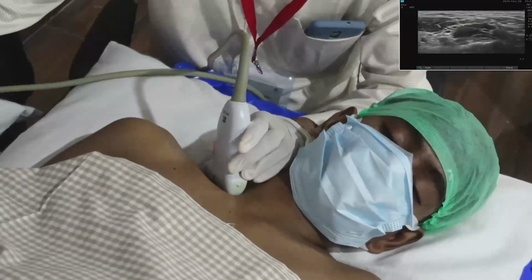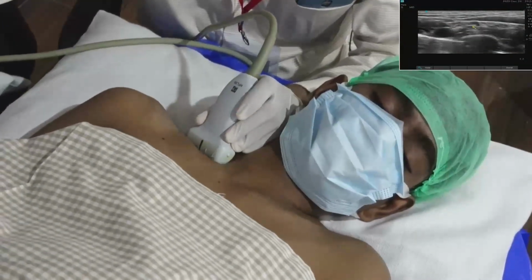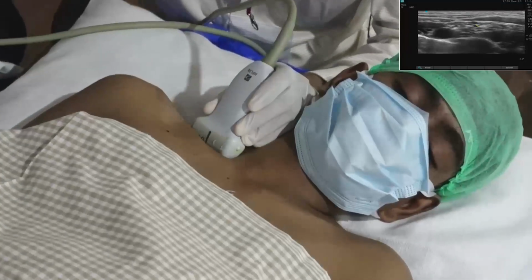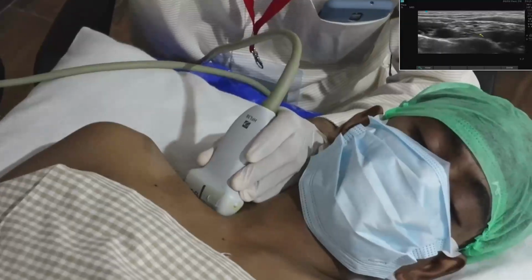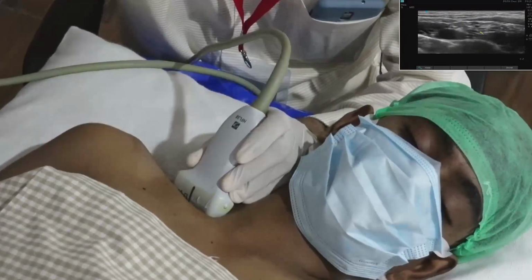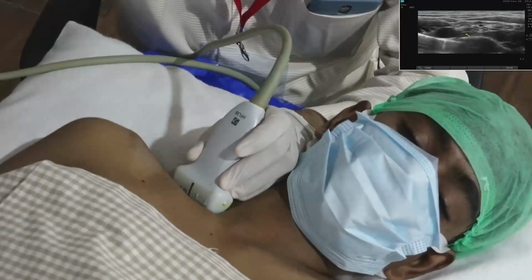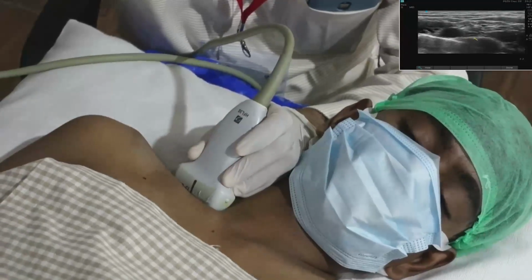It is coming and staying in the superficial area next to the omohyoid. This is the upper trunk. These neural elements are called the middle trunk and corner pocket. This area is called the corner pocket.